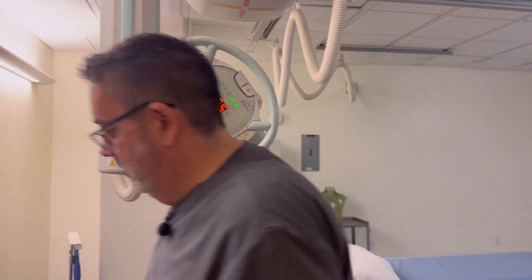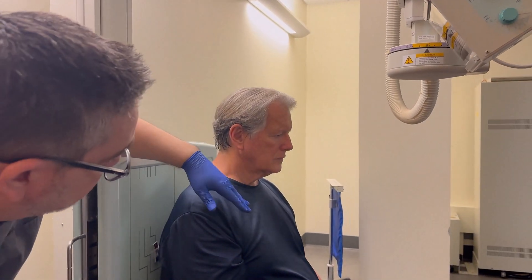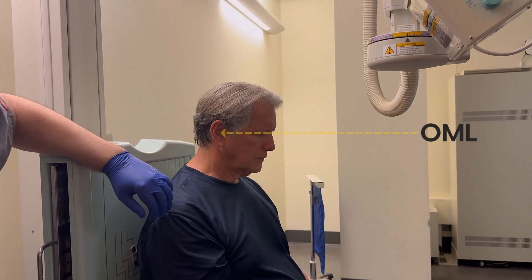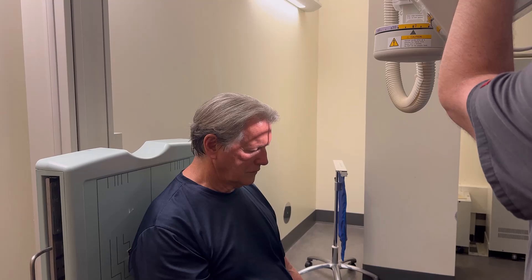So let's get our patient ready here. He's already sitting. Let me have you drop your chin — we're going to get this OML perpendicular. Drop it a little more. There we go, perfect. And I'm going to center right through the TMJs here.